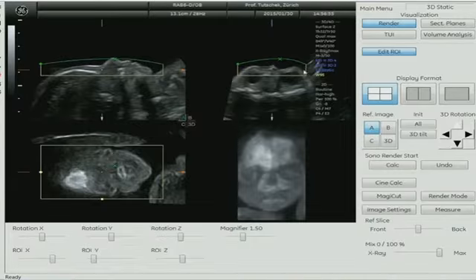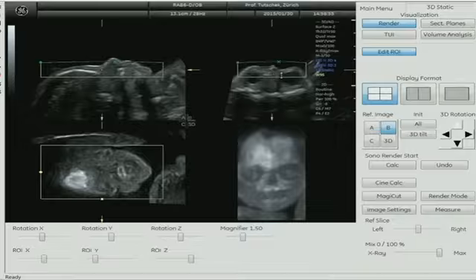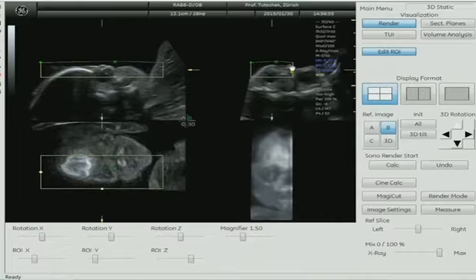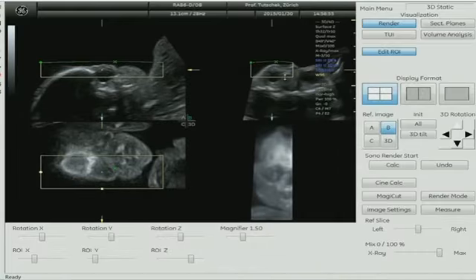Then down here we see the whole face, but do the following again. Bring it down to include just half of the face. Just half of the face will be enough. Avoid the back, the posterior part of the eye.